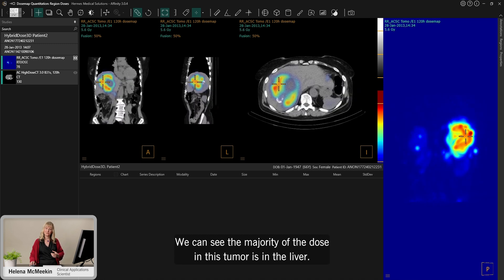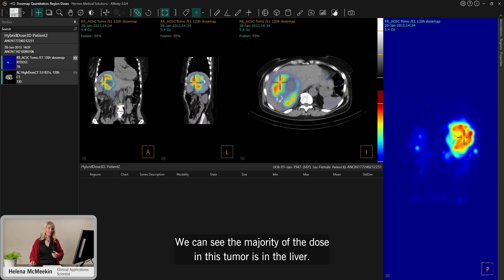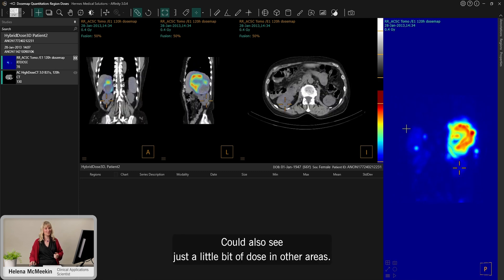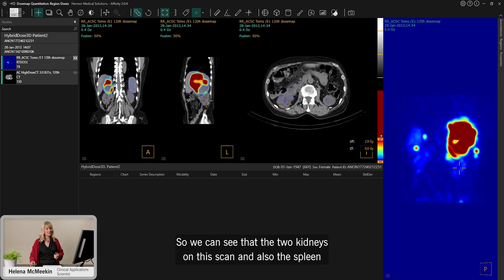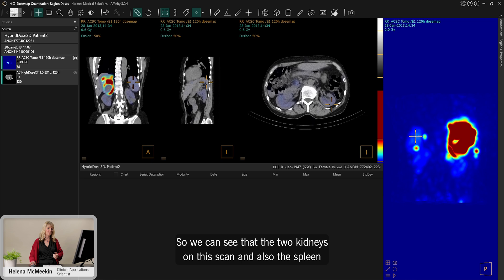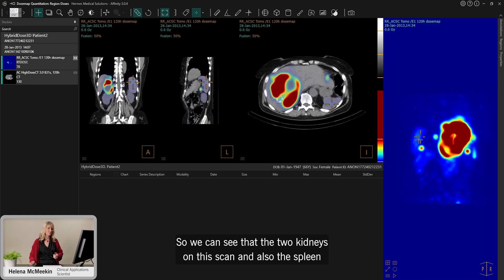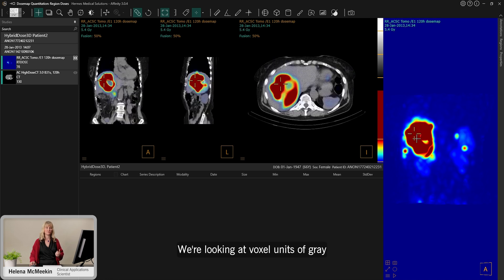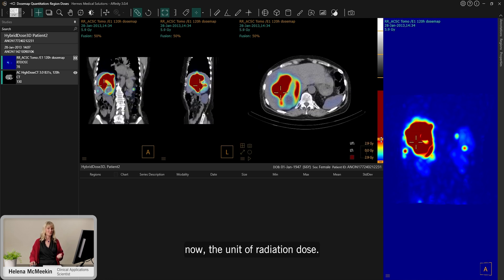We can see the majority of the dose is in the tumour in the liver — that's good, that's what we're trying to target. You can also see just a little bit of dose in other areas. We can see the two kidneys on this scan. Also the spleen over here has got a small amount of dose. So this is displayed in grey — we're looking at voxel units of gray now, the unit of radiation dose.